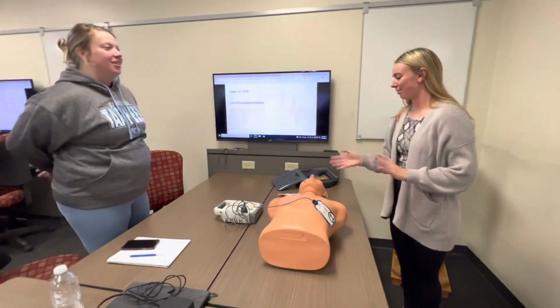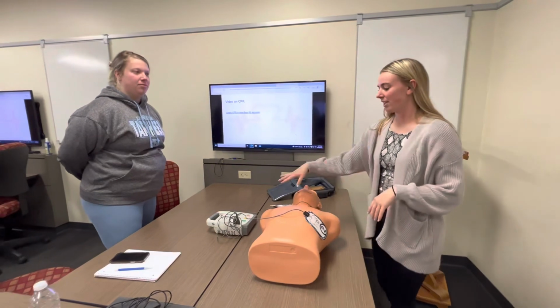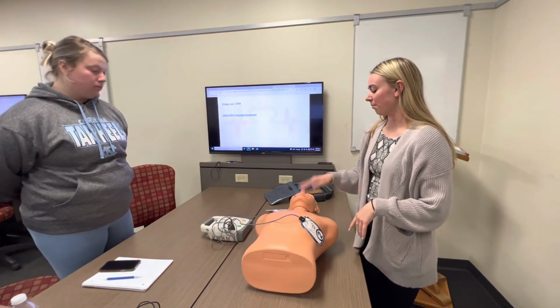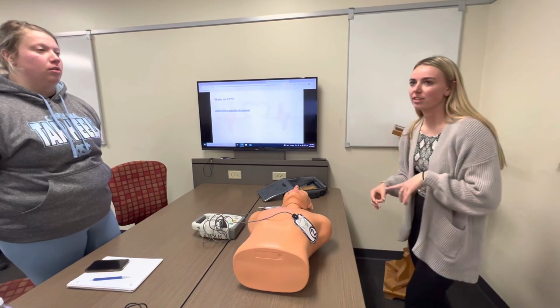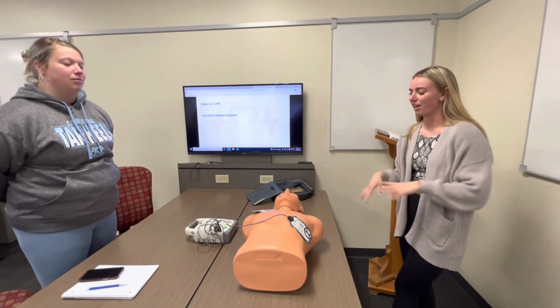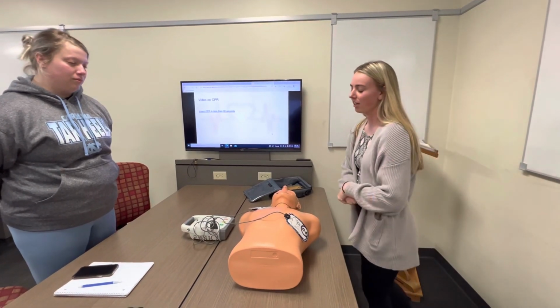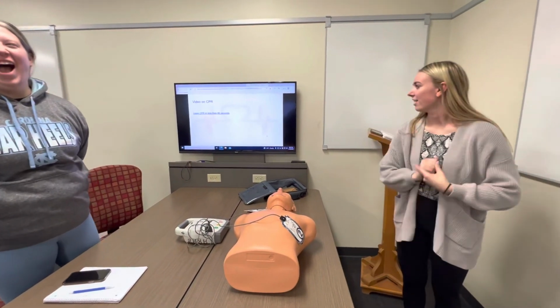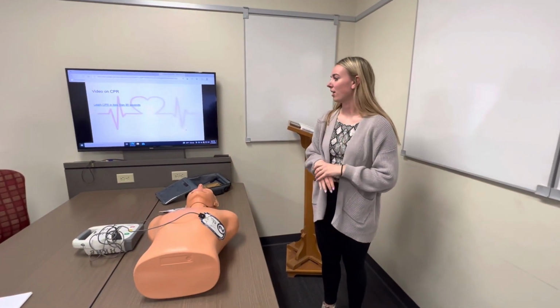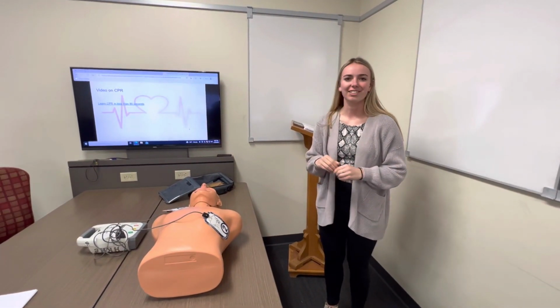So that's an example of kind of what you do. The AED would be talking to you normally and telling you exactly what to do. But yeah, keep the compressions. The only thing is when you first get there, make sure the scene is safe and ask if the individual's okay. But other than that, it was good. So yeah, that's a little overview on CPR and how to use an AED. So thank you.